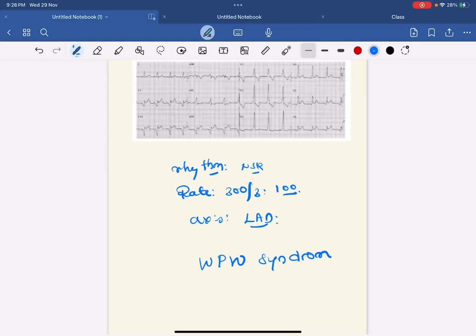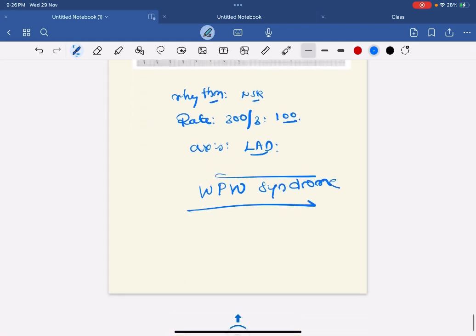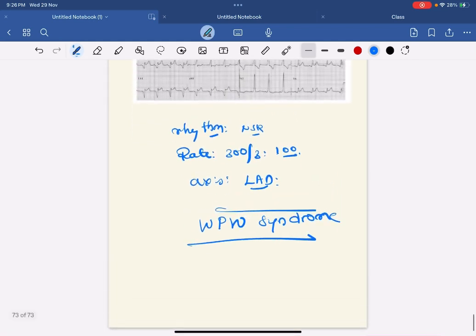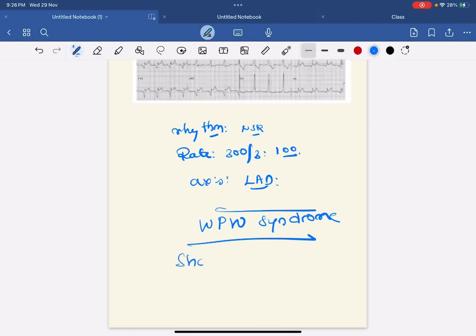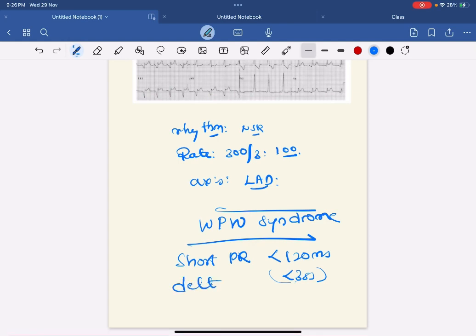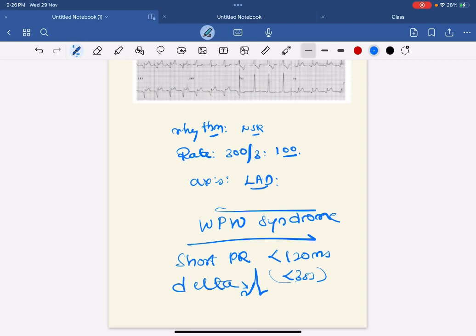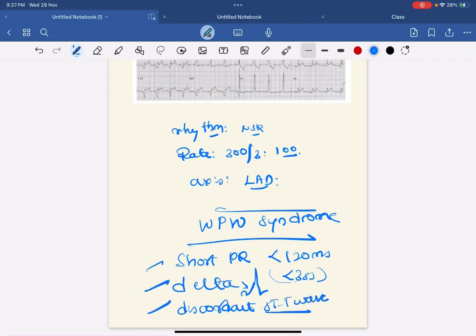So what are the ECG features of WPW syndrome? One is short PR interval, that is less than 120 milliseconds or less than three small squares. Then delta waves - delta waves are nothing but slurred upstroke of initial part of the QRS. Next, discordant ST-T wave changes. So these are the three ECG characteristics of WPW syndrome.